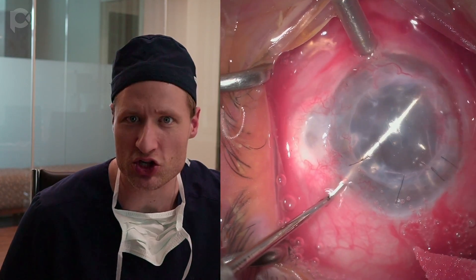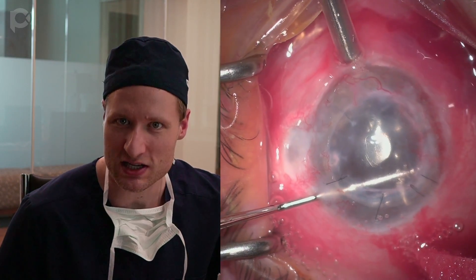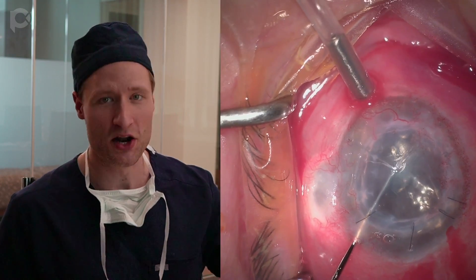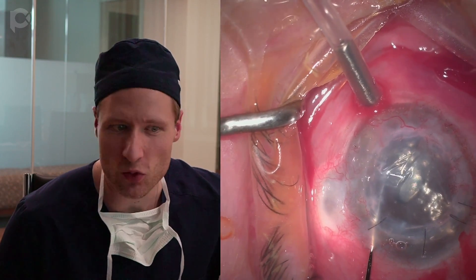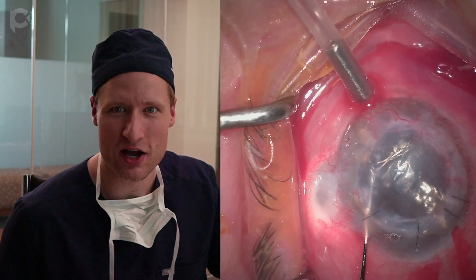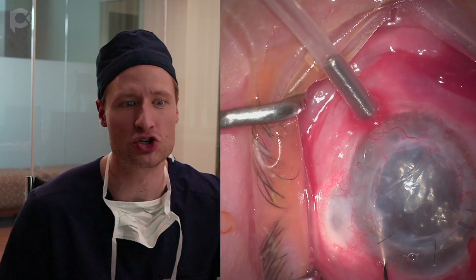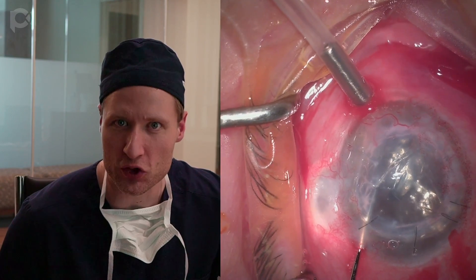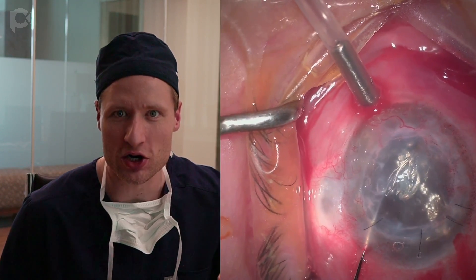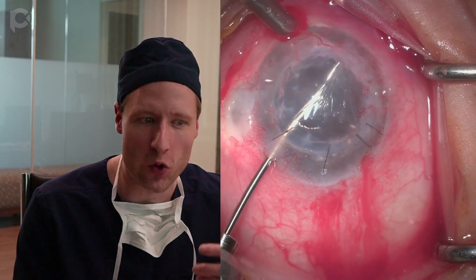I've got an anterior chamber maintainer going connected to air, and I'm scoring Descemet's membrane under air using an inverted Sinskey hook. Another lesson learned the hard way: initiate the score inside of the graft-host junction, not at the graft-host junction, because if you're not careful you can dehisce that wound from the inside. So I start just slightly inside that junction and score around.